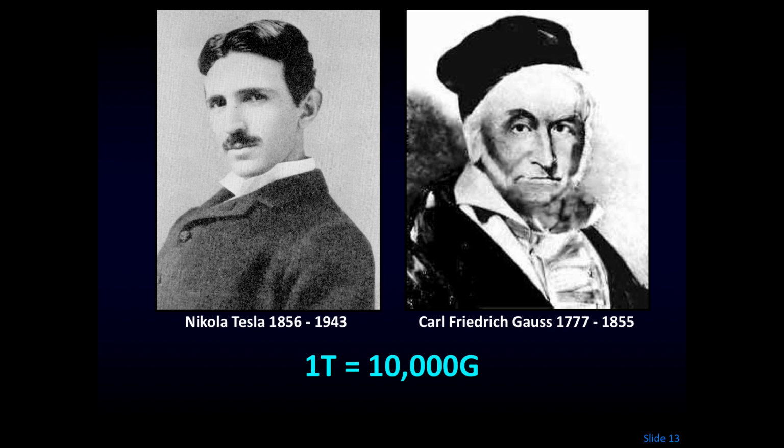Now we use the unit of Tesla, named after Nikola Tesla, who's one of the great, almost unrecognized intellectual heroes of the last 100 years, or 200 years. And 1 Tesla is equal to 10,000 Gauss, and this is Gauss over here.